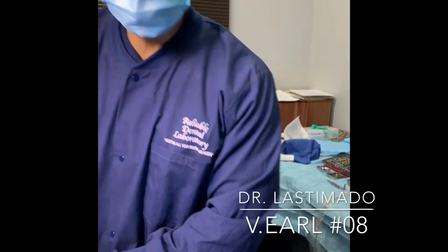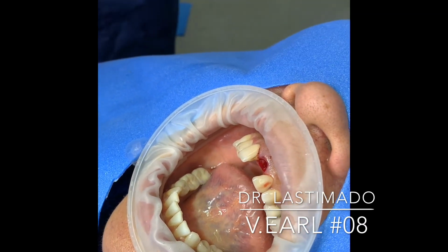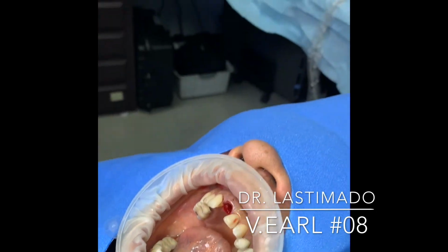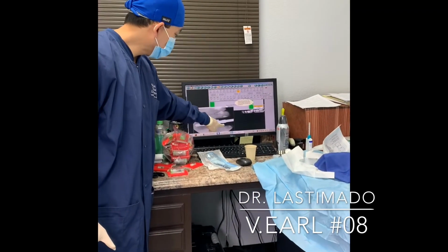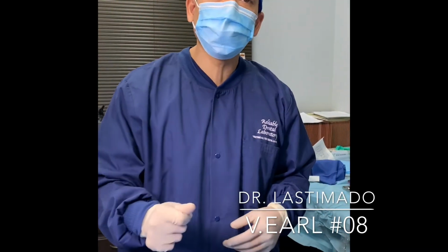And as you can see, we went ahead and atraumatically extracted the tooth. Very nice. We kept the papilla intact and went ahead and curetted and irrigated and cleaned everything out. We already created our osteotomy. If you want to see, we created our osteotomy already, straight down the center. And what we're doing here now is we're about to go ahead and place our Hyacin NH implant.